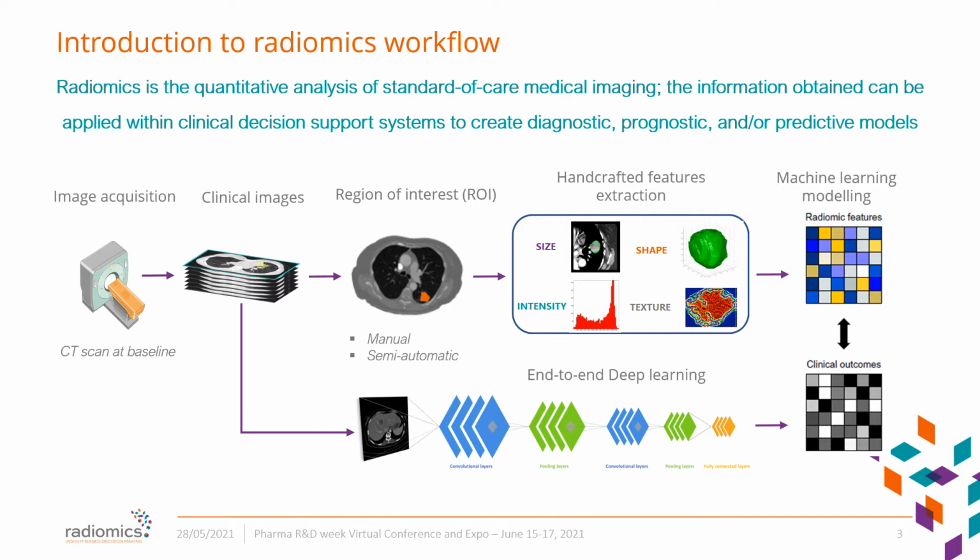So what is radiomics? Radiomics is a workflow to obtain a quantitative biomarker measurement from medical imaging in a repeatable, reliable, and relevant manner to support decision making. The process begins with image acquisition, the segmentation of a region of interest, manual or automatic, the extraction of features, handcrafted or deep, and then learning the link with the endpoint of interest, e.g., clinical outcome or a biological status.